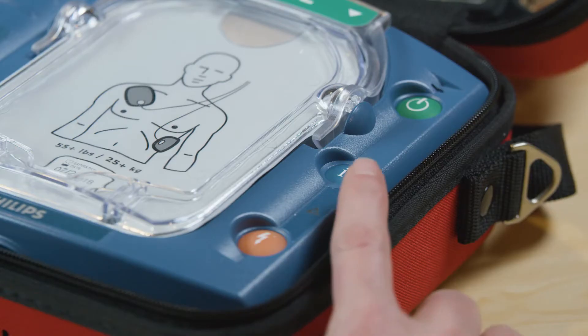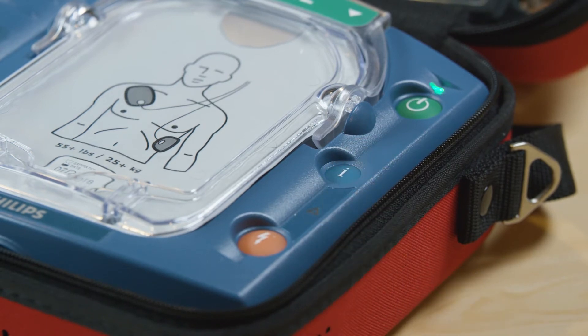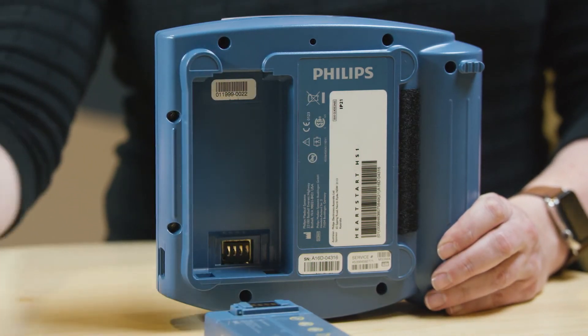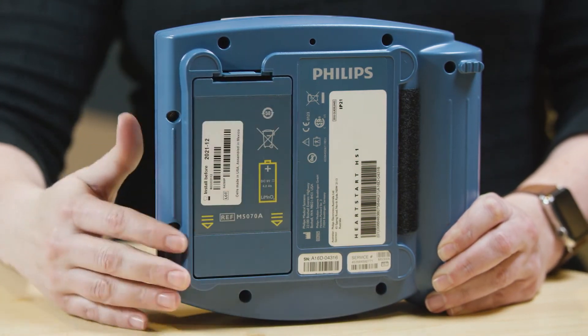Replace your battery when your device alerts you to a low battery and prompts you to insert a fresh battery. To change the battery, press this latch to pop out the old battery and slip in the new battery, pressing the top end down until the latch clicks into place.